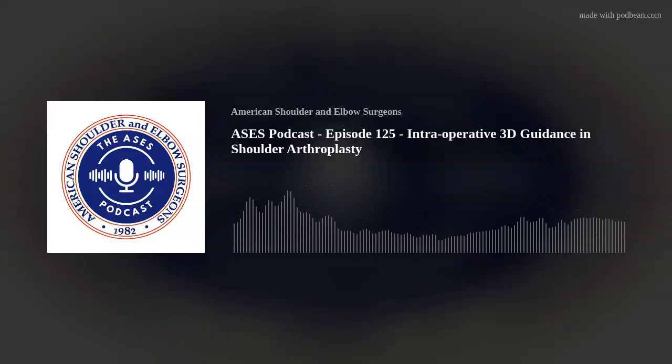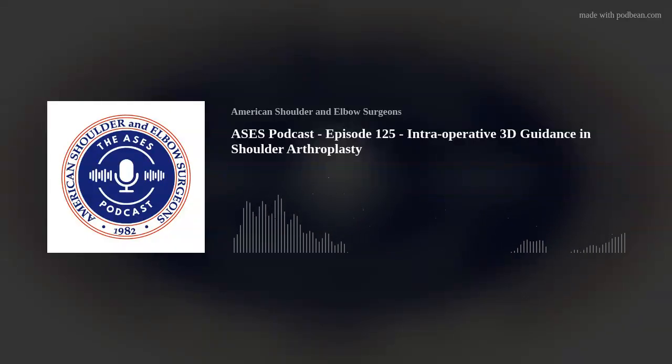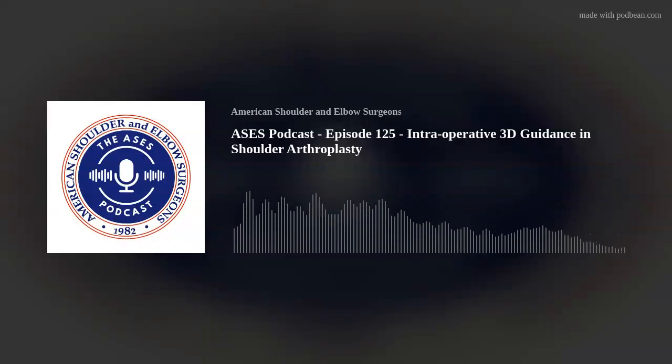Between 50 plus cases, we got that down to about 5 to 7 minutes. So, the reality is, it is going to be more time investment on the surgeon's part to do this case using robotics. You have to believe that the accuracy that you're getting out of it is worthwhile for you and your patients. There's also a learning curve, and then the financial implications.